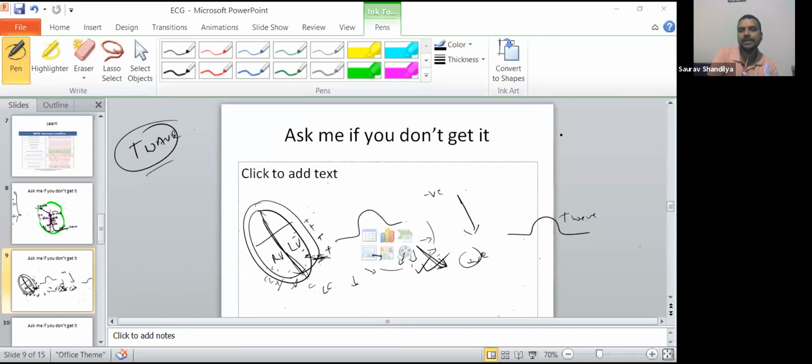Repolarization, I'm talking about ventricular repolarization. Can you please repeat ST wave? No, there is no ST wave, sorry. It was an ST segment.